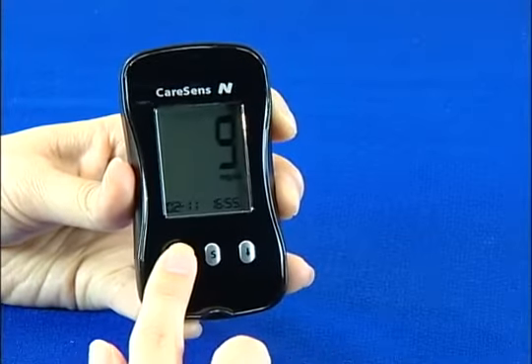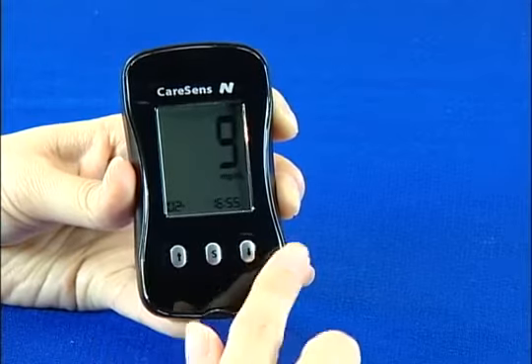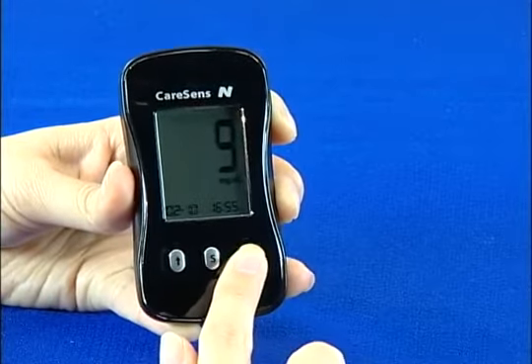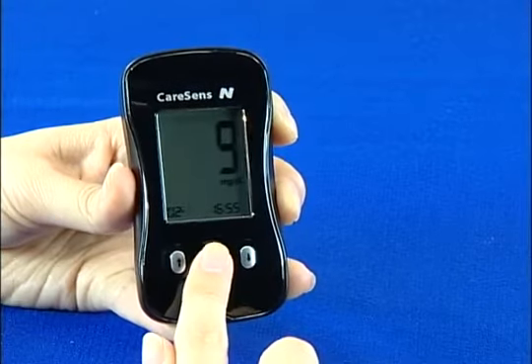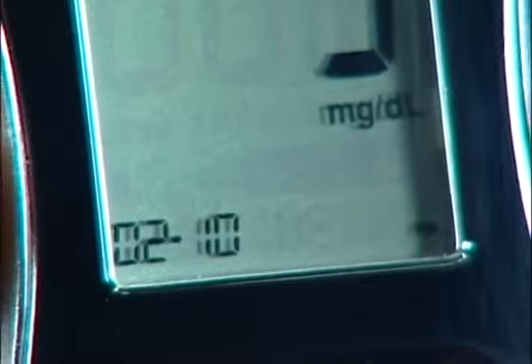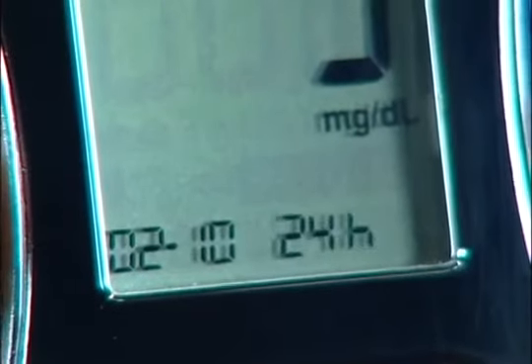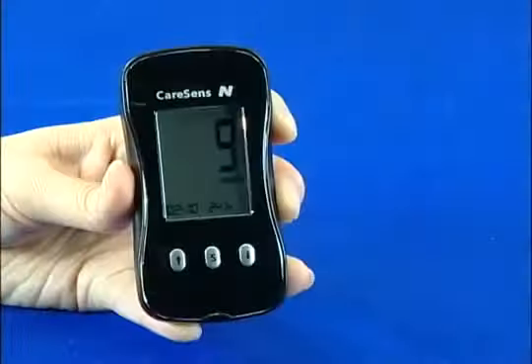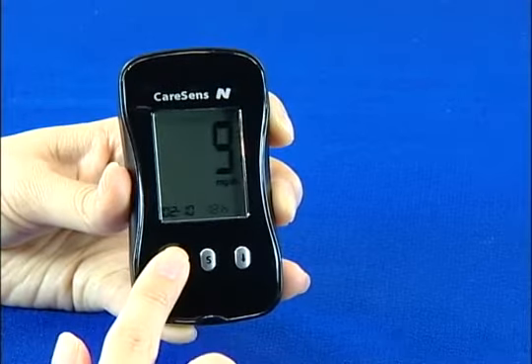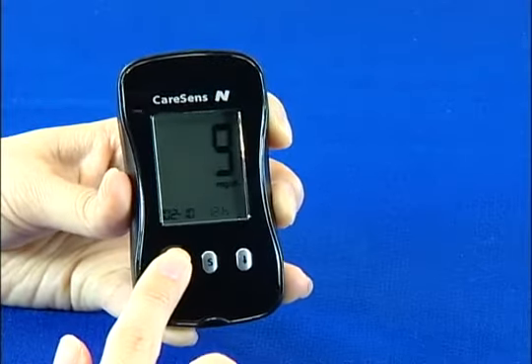The day can be changed in the same way. Press the S button again to set the time format. The time can be displayed in 12-hour format or 24-hour format. You can choose the format you want by pushing the left or right button. After setting the time format, press the S button to set the time.